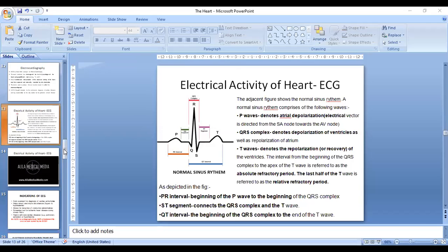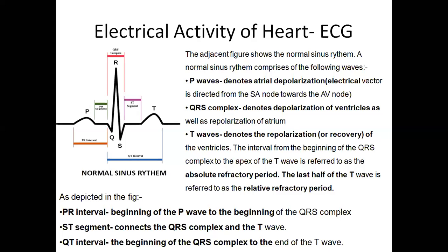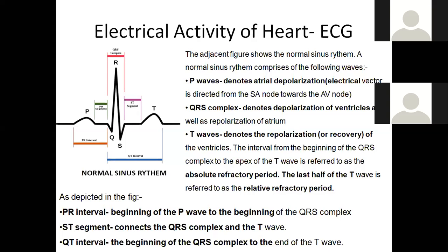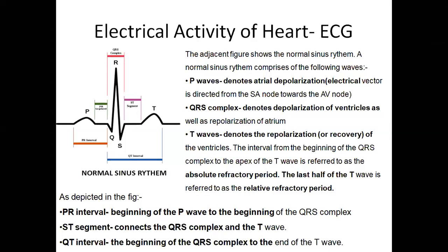Yes, sir. Okay. So here now today we will discuss what is the function of this ECG machine and probably the block diagram of ECG machine. So before going to this, this was the concluding section in the PQRST curve, which was developed for the electrical activity that is developed in the heart.